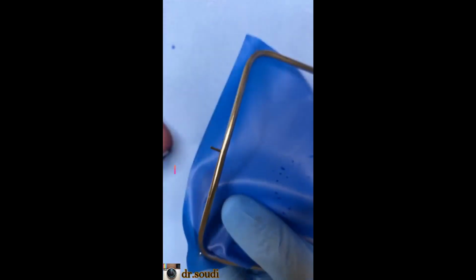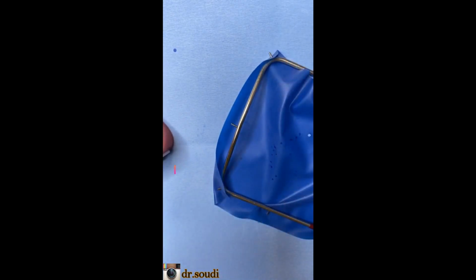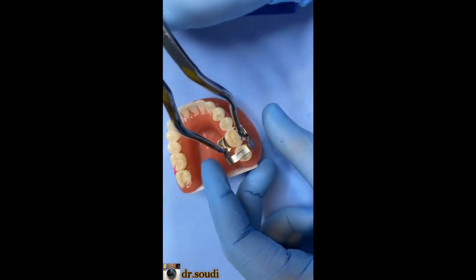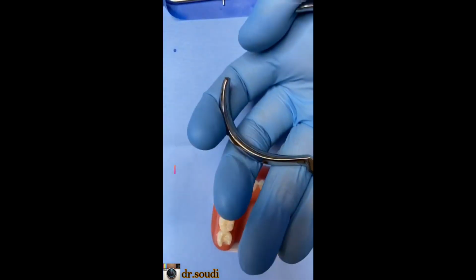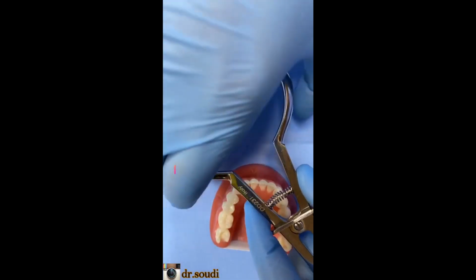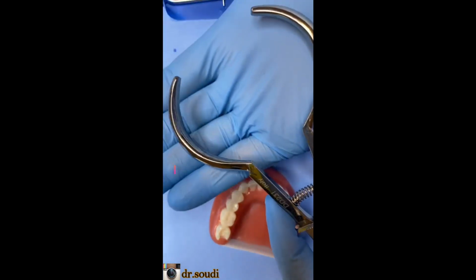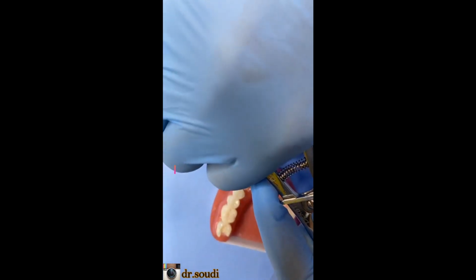This is the difference. So we have many techniques for placement. First of all, you can place your clamp like we said before. When you hold the punch, don't hold it from upward. You hold it from downward like this and press like this. Okay, don't hold it from here.